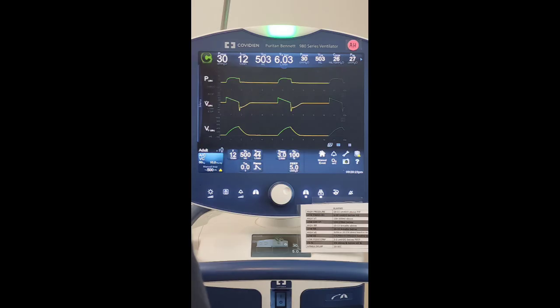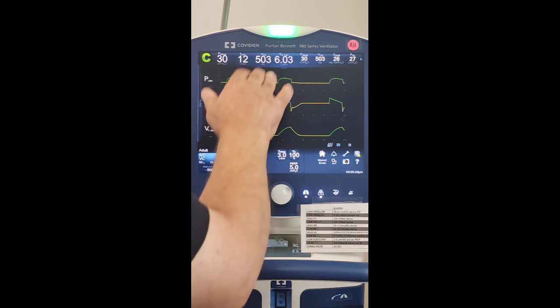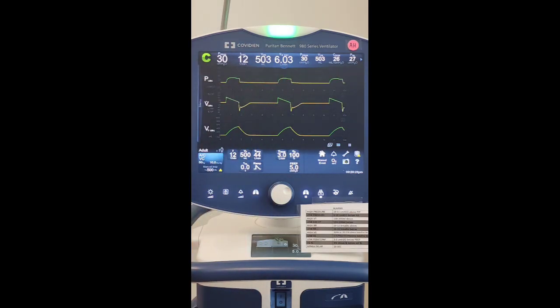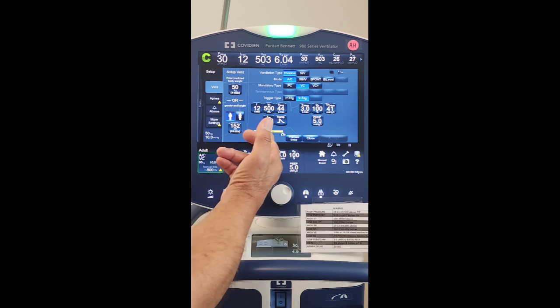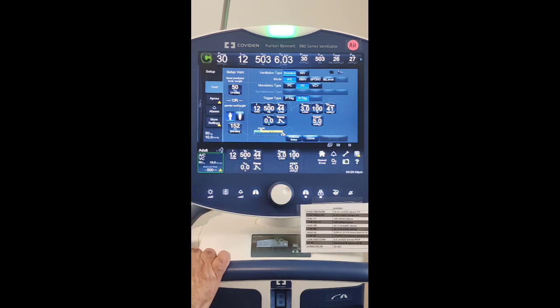So that is my goal, to maintain a minute ventilation of 6. Okay, so let's go back into the settings, and we can see the IE ratio here is 1 to 3. I want you to do your vent check, do the formulas for PF ratio, and I guess you can also do OI, oxygen index, on these settings here.